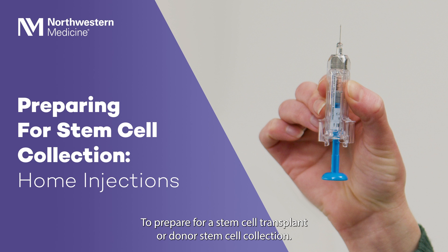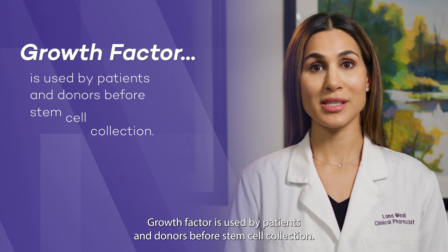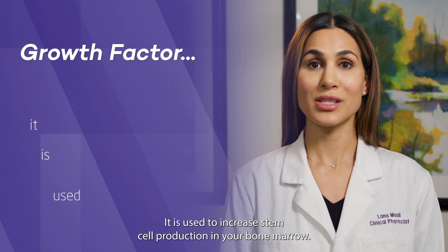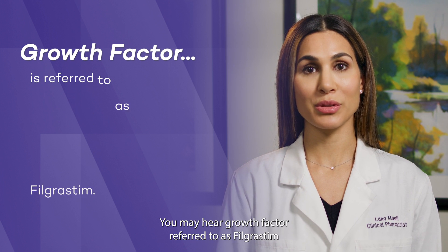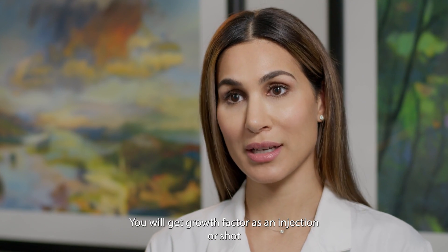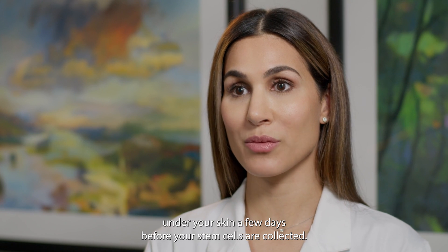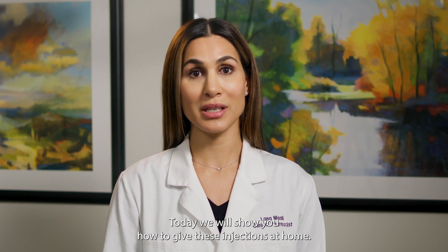To prepare for a stem cell transplant or donor stem cell collection, you or a caregiver will inject medications at home. This video will show you how to give the injections. Growth Factor is used by patients and donors before stem cell collection to increase stem cell production in your bone marrow. You may hear Growth Factor referred to as Filgrastim or one of the brand names Neupogen, Granix, Xarxio, or Nivistim. You will get Growth Factor as an injection under your skin a few days before your stem cells are collected. You can give these injections to yourself or a caregiver can give them to you.